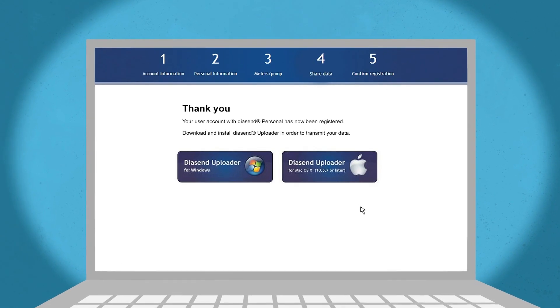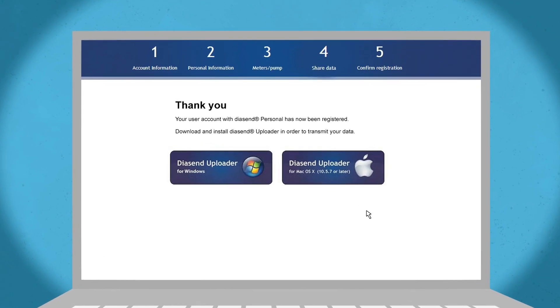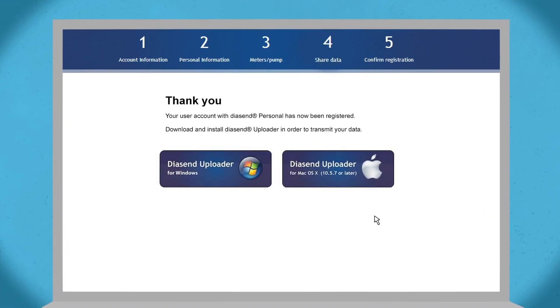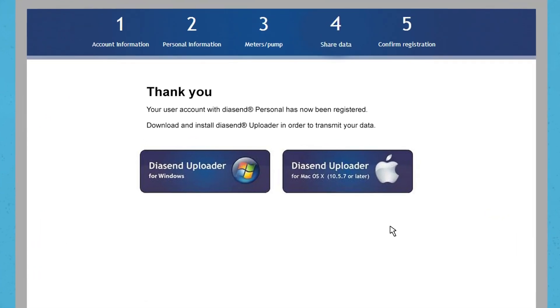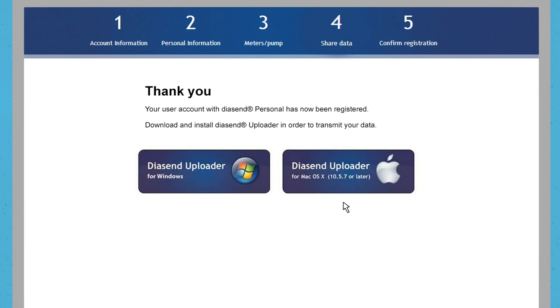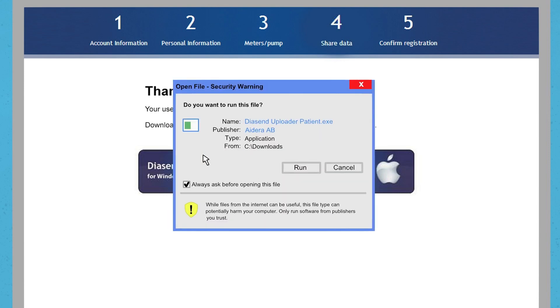Once you have finished the registration, you have to download and install Diacend Uploader software. It's available for both PC and Mac. Click on the PC or Mac icon to download the Uploader software. Once the file has downloaded onto your computer, you will need to run it and follow the steps on your screen to install the software.